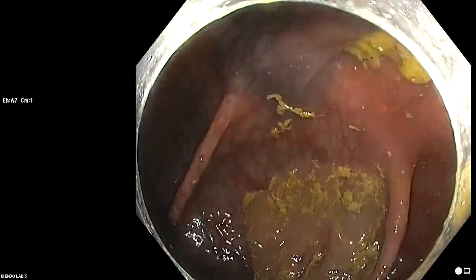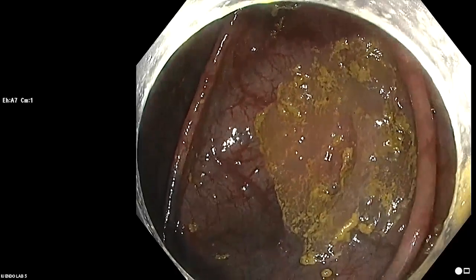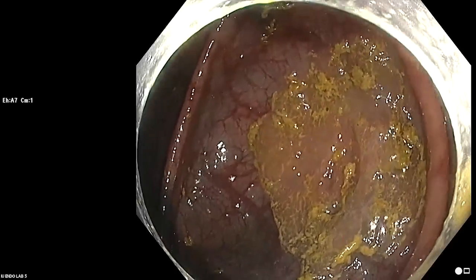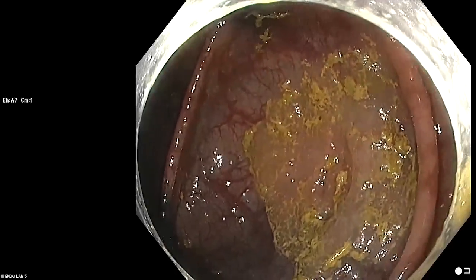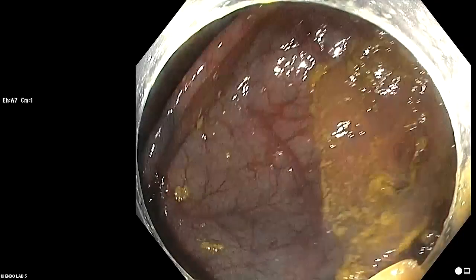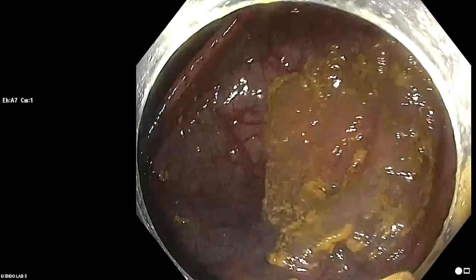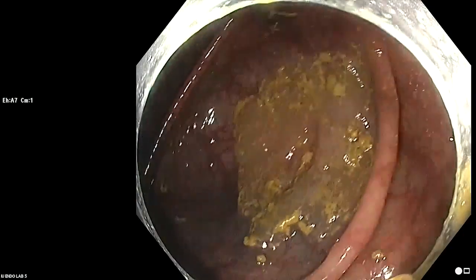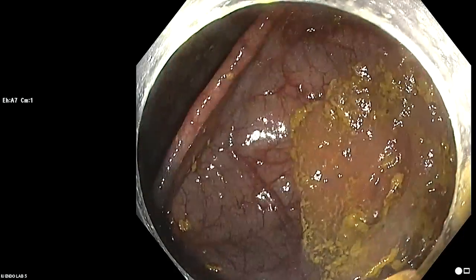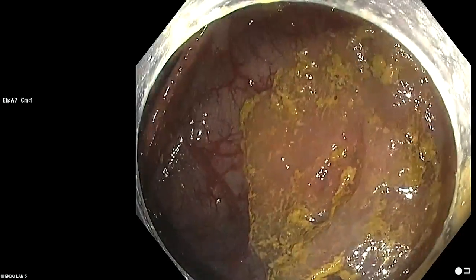The other thing is, I see a lot, and this was the case here, people put in a tattoo and they don't specify where the tattoo is in relationship to the lesion. So every time you put a tattoo, you should say, I tattooed 3-4 centimeters distal to the lesion, or I tattooed on the opposite wall, and try to stay far enough away. You have to remember that these tattoos spread out substantially over several centimeters. With the new Spot EX, which I used in the last case to tattoo the rectosigmoid junction, you don't need very much, especially for endoscopic follow-up. Half an ml to 3/4 of an ml is plenty.